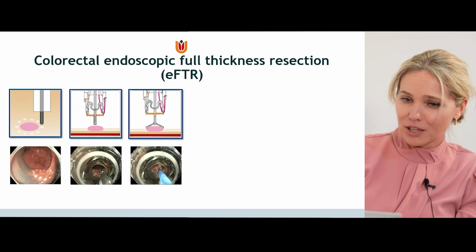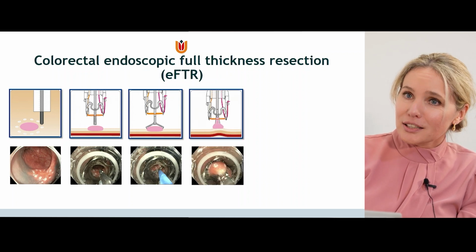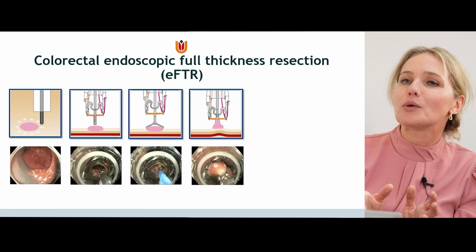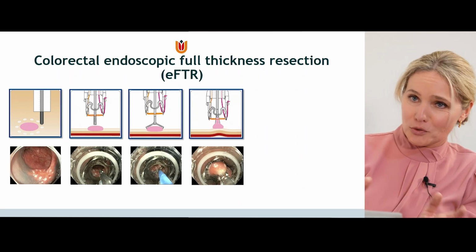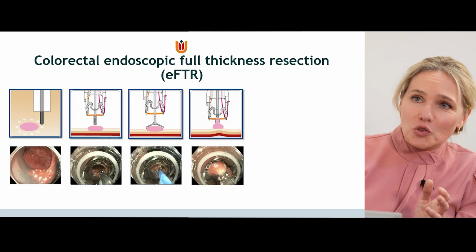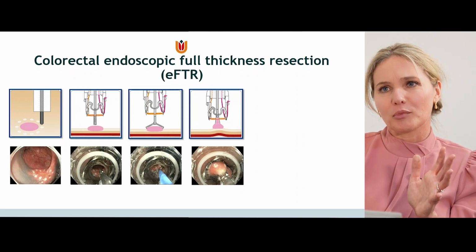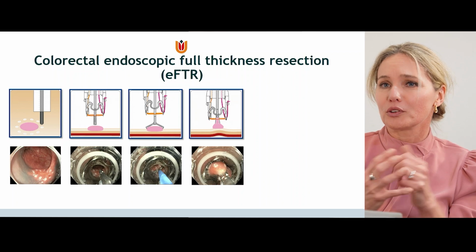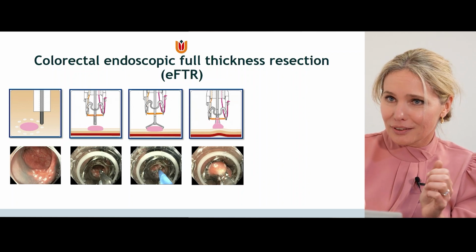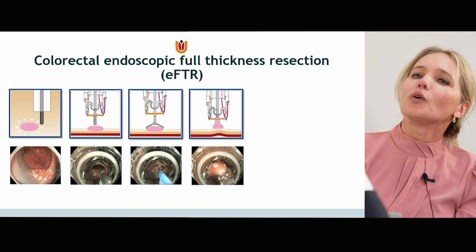But you grasp the lesion and then you slowly pull the lesion into the cap. In the perfect procedure you will see all the lateral markings entering your cap, but in realistic procedures you don't always see the markings clearly come into your cap, but you see the popping of your target area into it. And if you pull very effectively, you see nothing. Because the lesion is very close, huh?